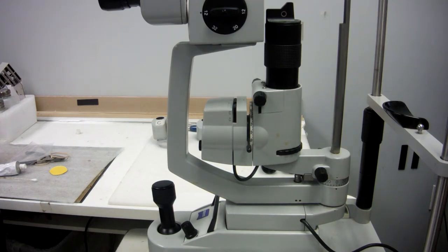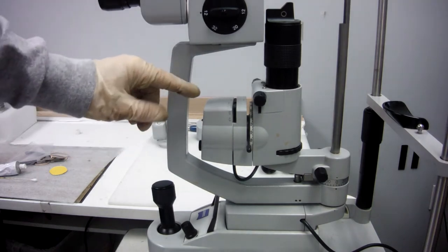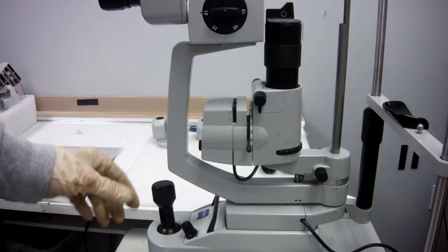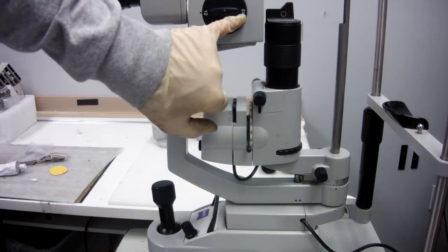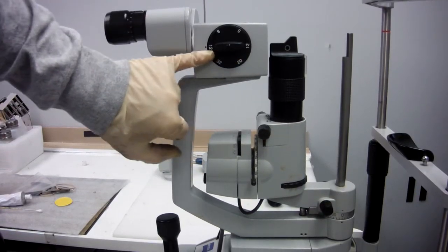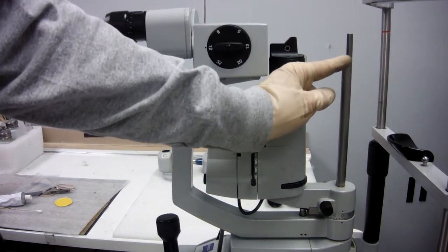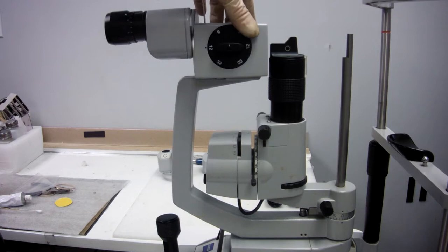On the SL120, if you were aligning the head, if I were doing it, first of all, I would look through the viewfinder. I would look through the binoculars and make sure that I have equal space on each side of the bar. This would be the 12 power. There's no lens, so you're looking through clearly, and I would look at the space on each side of the rod to make sure my head is centered.